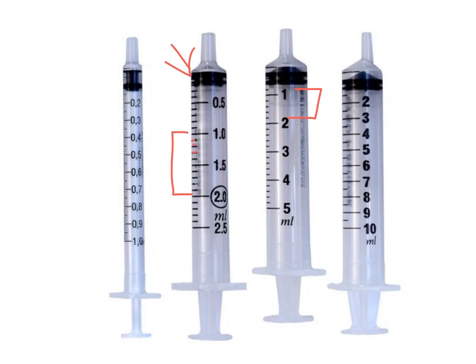1, 2, 3, 4, 5, 6, 7, 8, 9. This is the one that we count off as 0.1. Sorry, that's a horrible looking one. 0.1, 0.2, 0.3, 0.4. We count in order between our whole numbers.